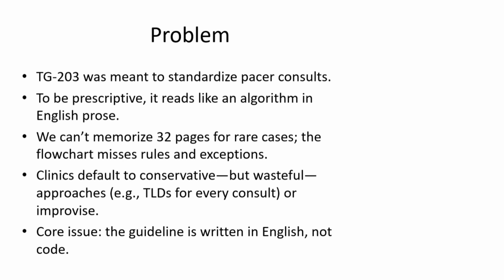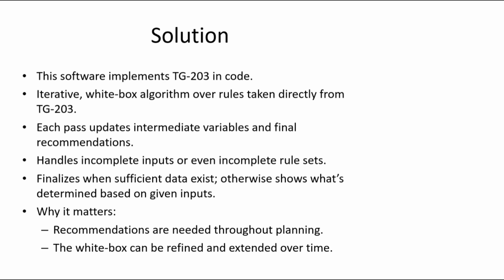The core issue at the end of the day is that the guideline was written in English prose when it really should have been written in code. So the solution naturally is to actually just put TG-203 into code. And so this software is an iterative white box algorithm over rules taken directly from TG-203.